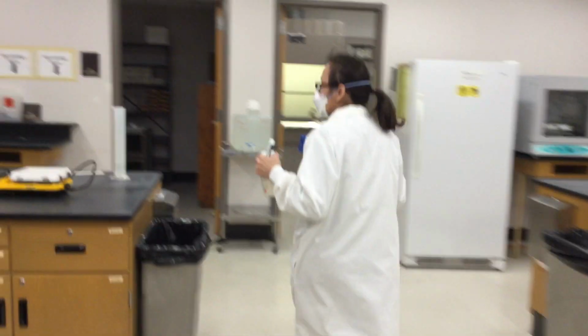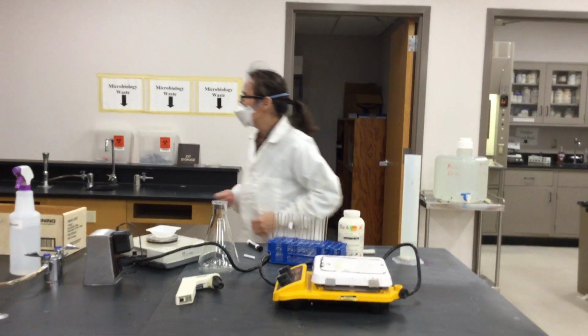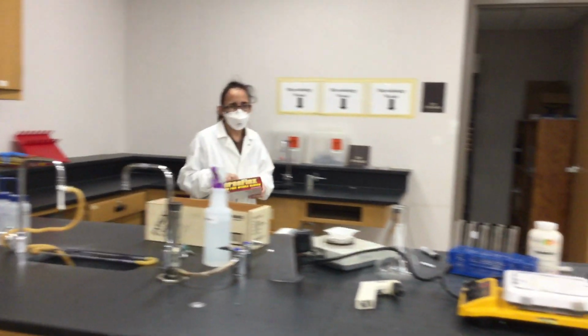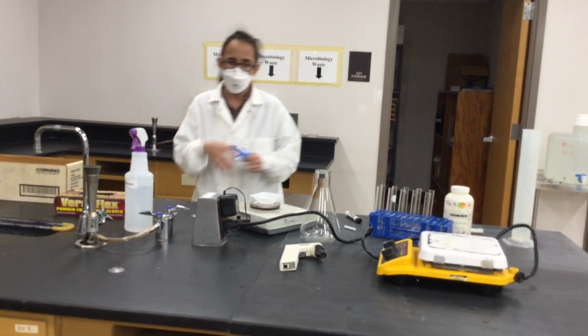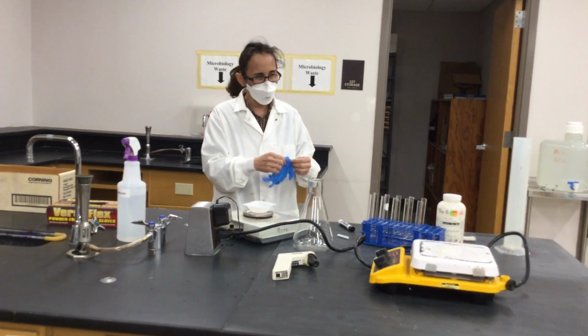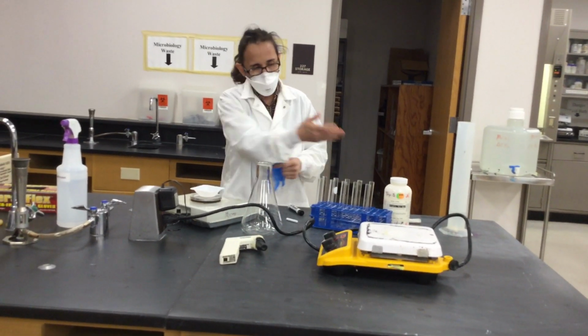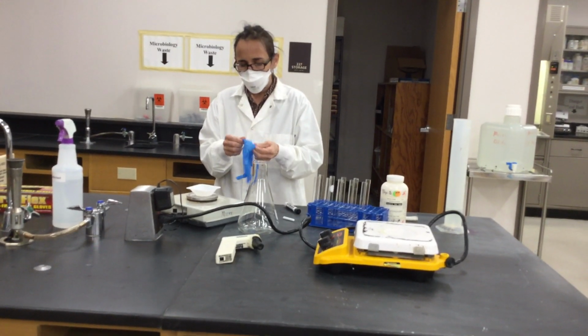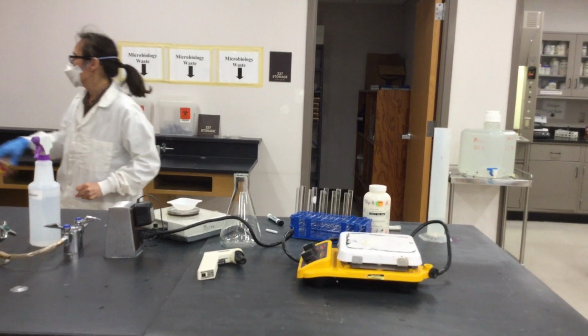So you're supposed to have several materials when you will be preparing media, including your gloves. Many of these powders are very sticky to your hands, so you don't want to have your hands filled with this powder. When I was explaining, you can feel that the outer part of the container is powdery already. So you will have your gloves.